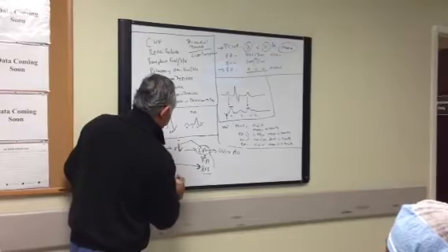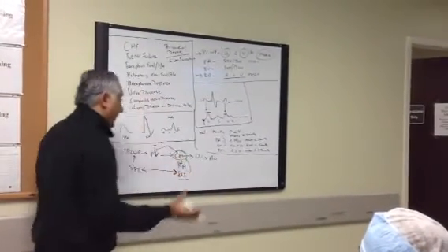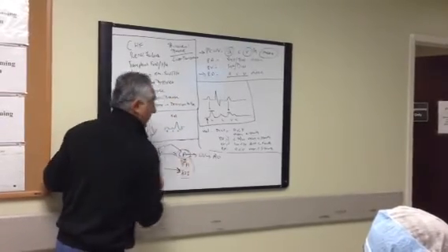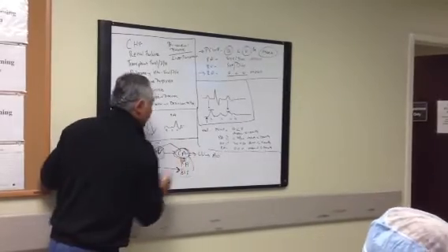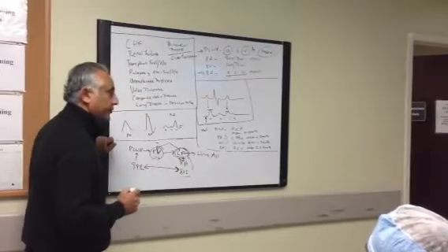Now, what if I have, let's say I got into the left atrium, then hopefully I can get the pulmonary vein. So maybe I can get a pulmonary vein sat and a left atrial sat. Okay? So if you've crossed over, then you want to do these two because you want to see, is there a right to left shunt?